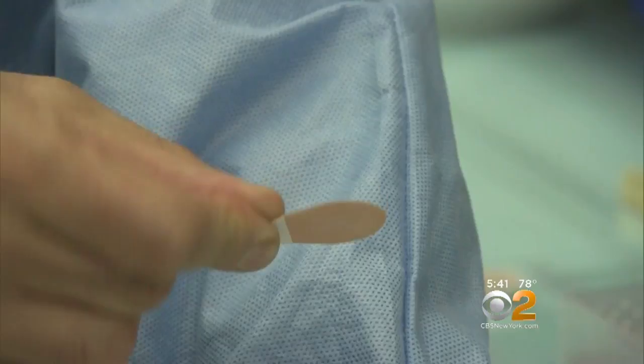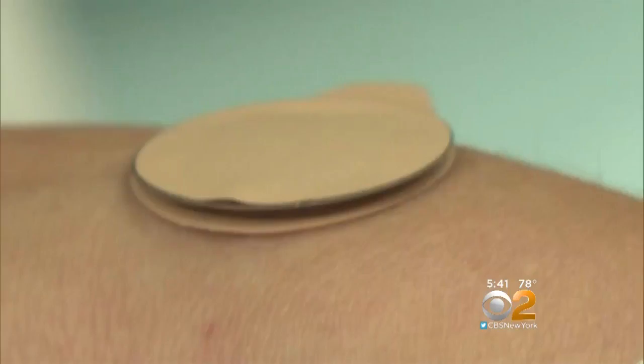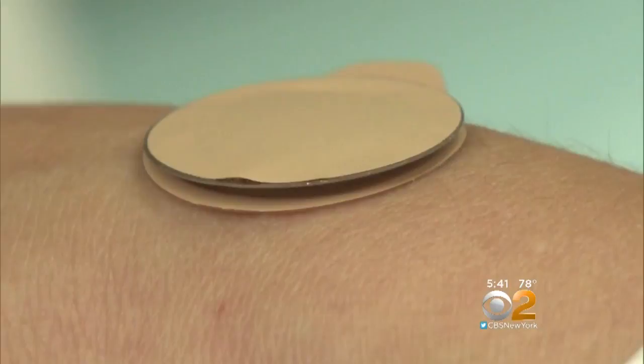More than 70% of the volunteers preferred the patch over the usual injections, which researchers say could increase vaccination rates. Our goal is to make it so that people can receive their flu vaccination at home by themselves, without the complexities of having to know how to use a needle and syringe or having to go to a doctor or a nurse.